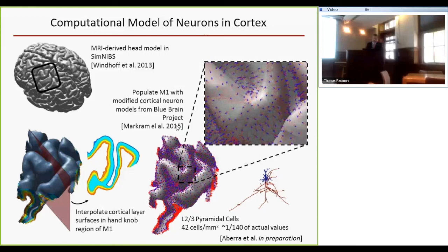With that, you can do things like strength-duration curves, which you can also do with conventional devices. You can vary the pulse width and get multiple thresholds for different pulse widths. Here we ran our model also with these different pulse widths, and the red curve is the strength-duration curve that we got from the model, and the black curve is what we got from the experiment. The overall amplitude we individualized, so we normalized so that we can see the curvature, and the curvature matches really well between the model and the experiment.